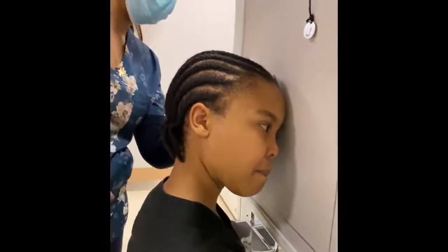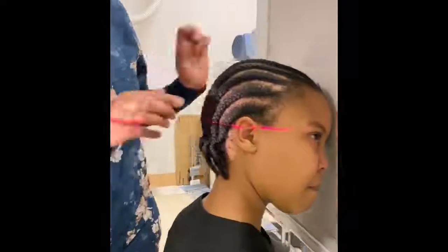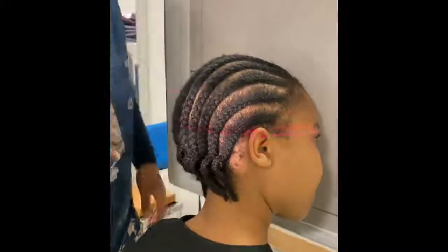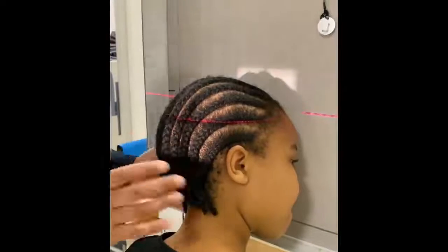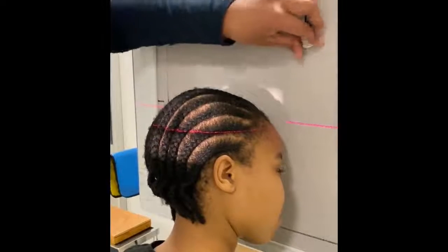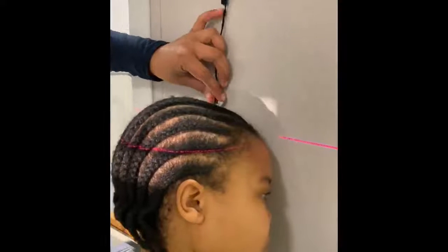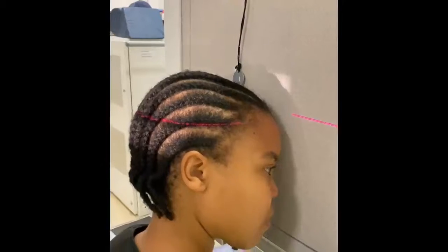The downside orbit is the left side, so I'm just going to bring my finger more or less to that area where we need to center. Then we just need to collimate as well. Remember to place your marker. We're demonstrating the left side, so we can put our marker readable on the left side of your patient.